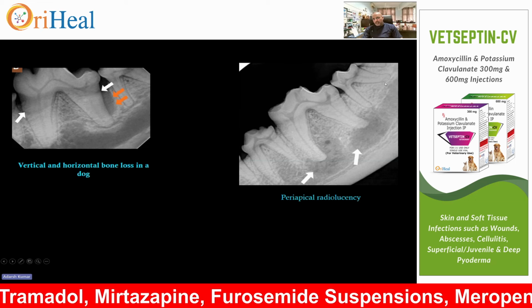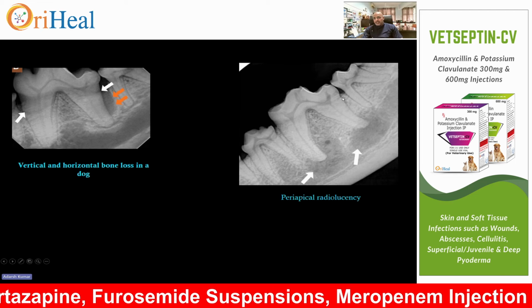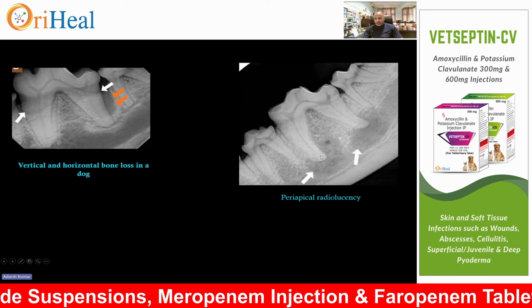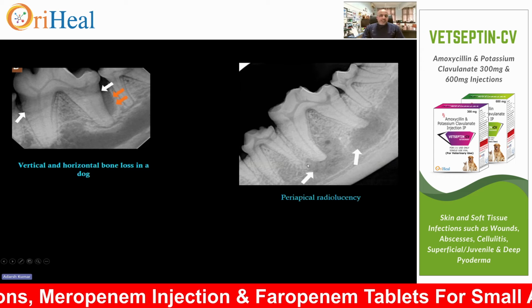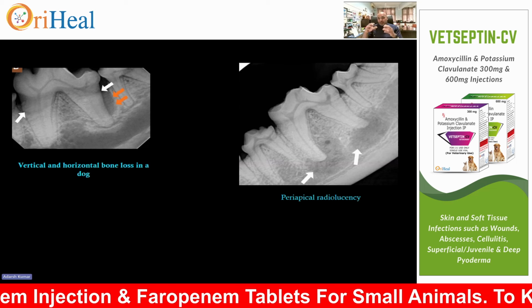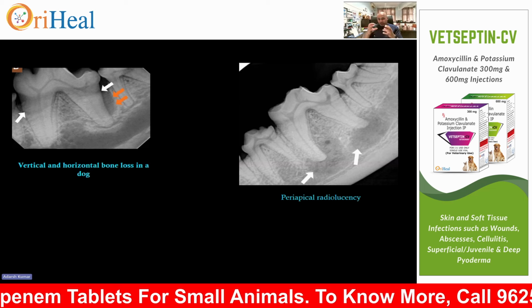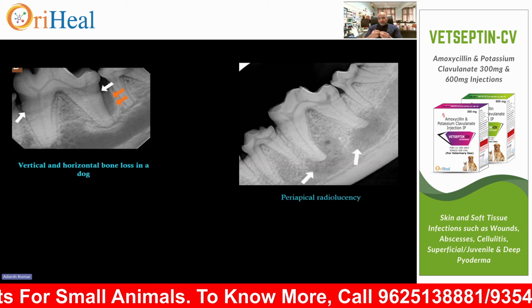Periodontal ligament is intact. So ideally, when you take the X-ray and you watch the PDL, if you find loss of PDL here, it is being lost. Here it is okay. Here it is okay. Here it is lost. So when PDL is lost, you can foresee and keep in mind that the tooth is eventually losing its apposition, its placement in the alveolar socket, and consequently it will be loose and has to be taken out.